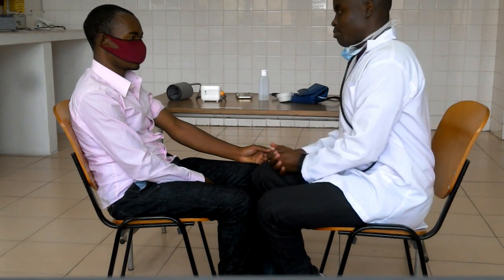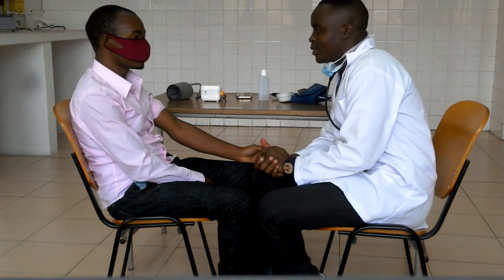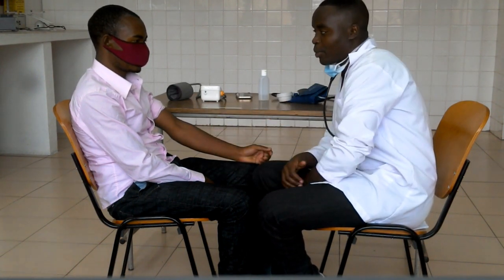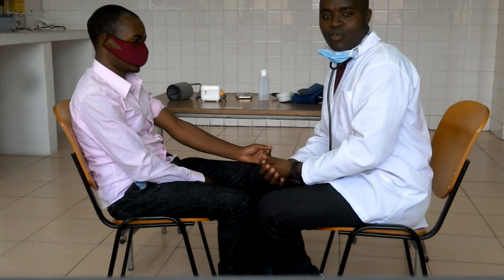Welcome. My name is Mr. Shadrach. Today I'm going to take your blood pressure. Another thing — you have to make your patient comfortable. Tell your patient: this is not painful, this is not harmful, so that they will feel very comfortable. This is not painful, don't worry, there is no harm, feel comfortable.